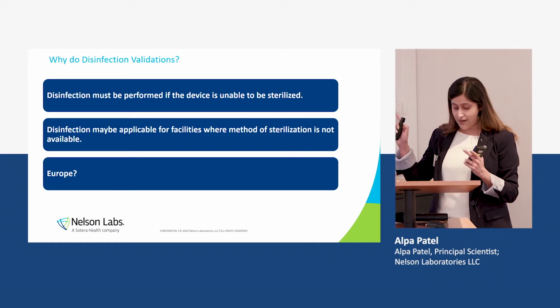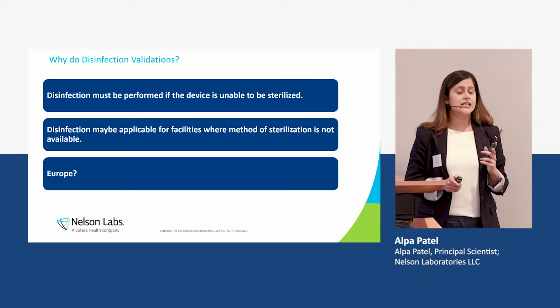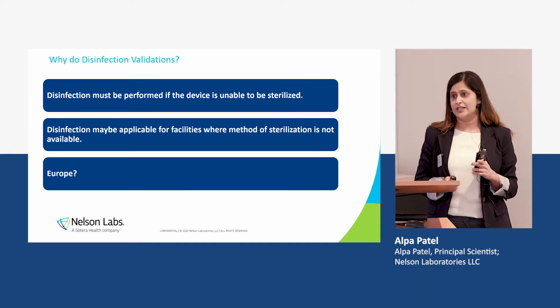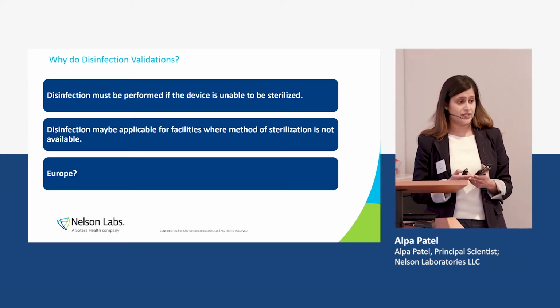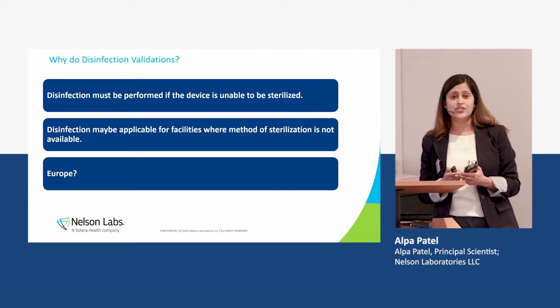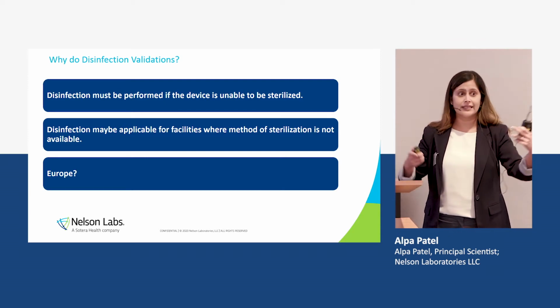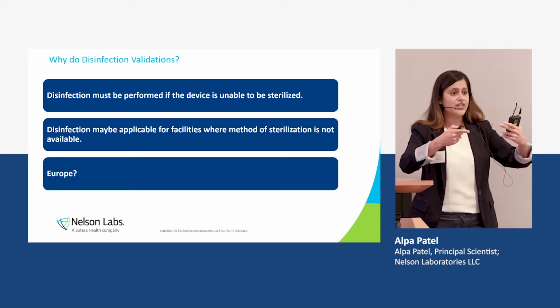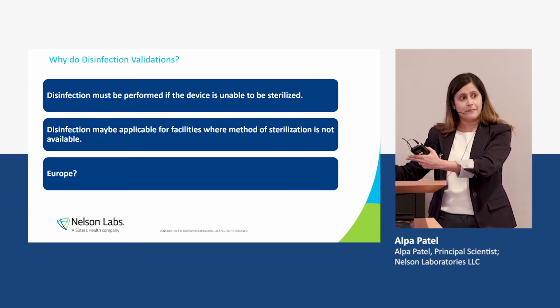I've got a question mark in Europe for the reason that thermal disinfection is something that is almost required in Europe for healthcare users. It's not for your device, however, it's for the users, the end process. So when it goes to the automated washer, like Lisa talked about, the other side, the users are pulling them out and getting them ready for sterilization, right?